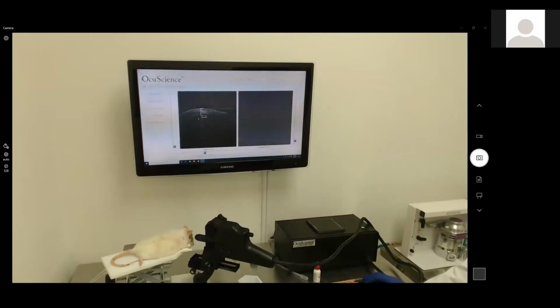So all of those tools are basically usually available on almost every OCT system. One of the things that OCT systems should also have is the ability to do measurements. Sean's up here, showing how we can do some real-time measurements of the 2Ds on the screen, and we can of course save those. There are other software programs that you can purchase for segmentation and other measurement analysis.